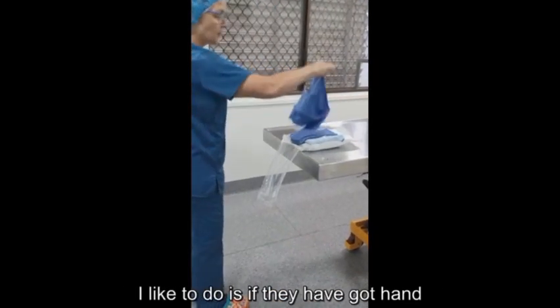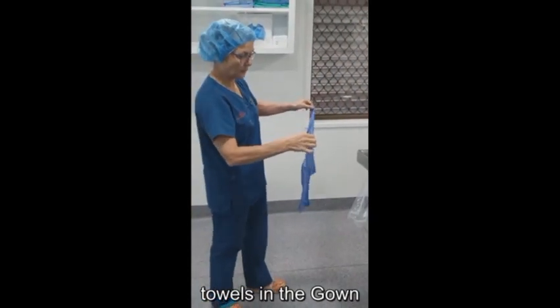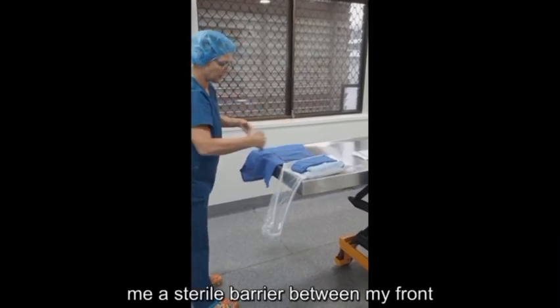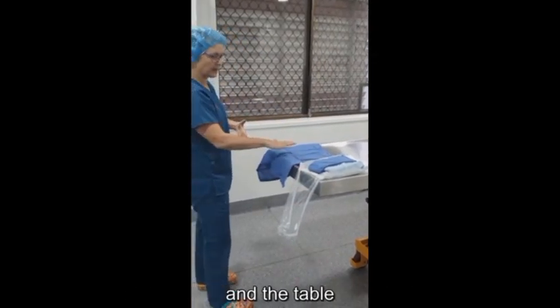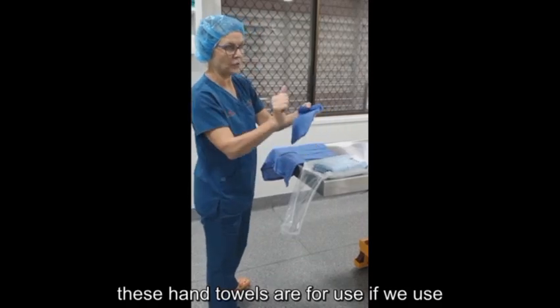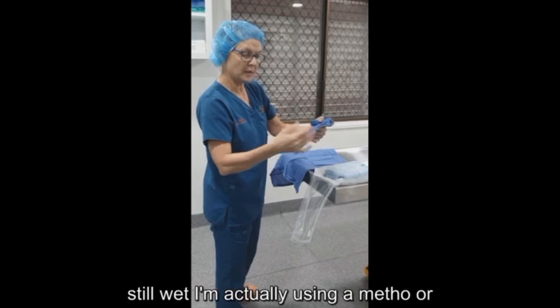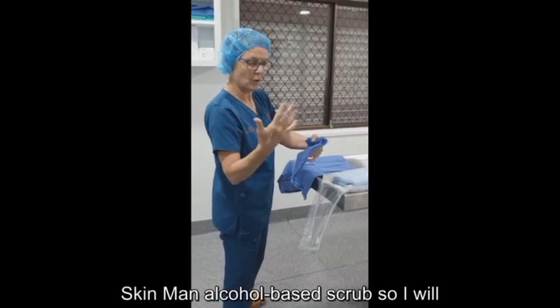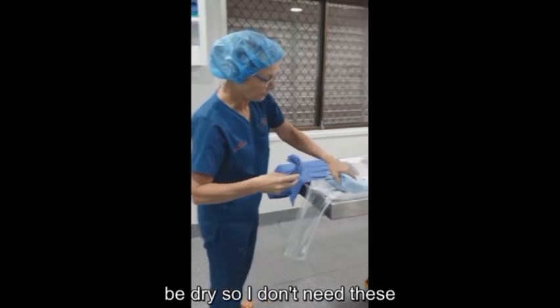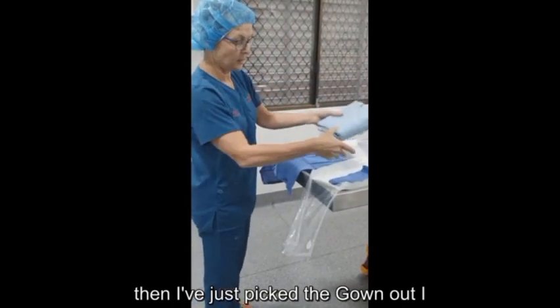What I like to do, if they have got hand towels in the gown kit, is put that down here. It gives me a sterile barrier between my front and the table. These hand towels are for use if we use the chlorhexidine scrub where we're still wet. I'm actually using a Metho or a Skin Man alcohol-based scrub, so I will be dry. So I don't need these. Put that away.